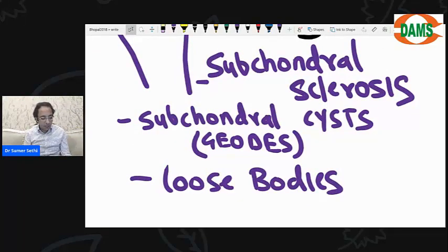I will revise it, and you will hear it multiple times in orthopedics. Now, why is loss of joint space happening, beta Sri Lakshmi? Try and understand. Because in a cadaver there is no joint space. Joint space is only seen on X-ray. In a cadaver, the articular surfaces of the bone are covered with cartilage, but you don't see it on an X-ray. That's why we see joint space. If the cartilage is lost, the joint space will be lost. Are you able to understand the concept?